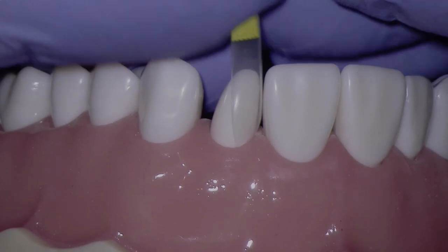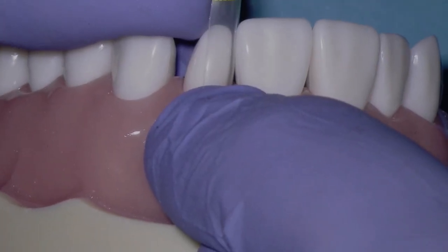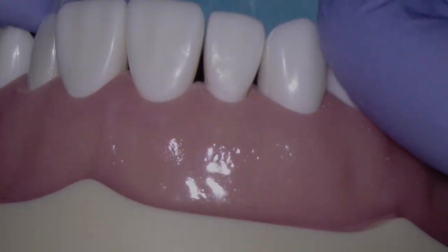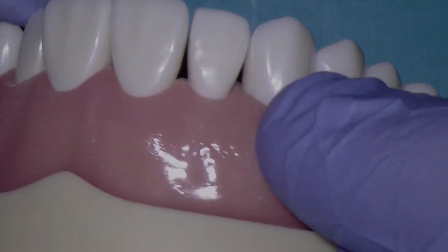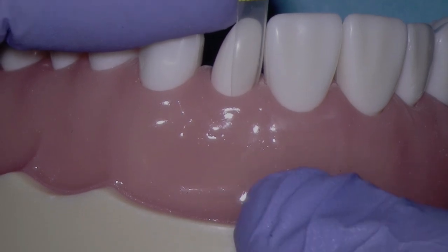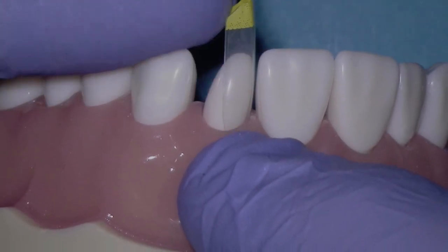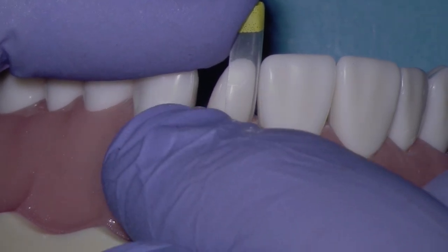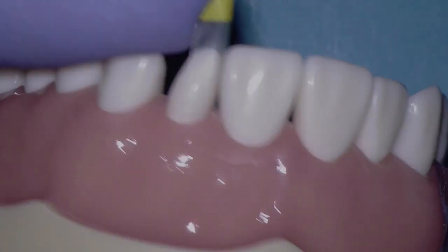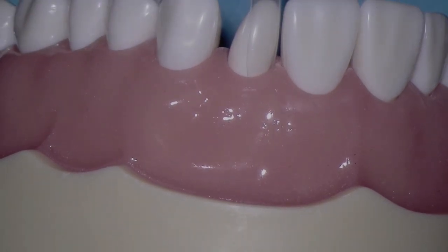In this particular case, the dentiform does not have realistic soft tissue. On a young patient, you would definitely have a papilla here. So we're really matching the anatomy of the tooth on the other side. So obviously, we would not leave a black triangle on an adult, but because the dentiform is unrealistic, we're going to go ahead and use the yellow on the mesial and the green on the distal so that we can match the anatomy of the contralateral tooth.